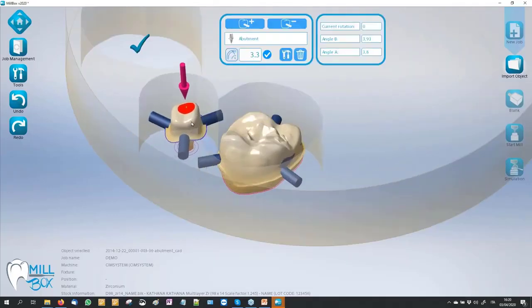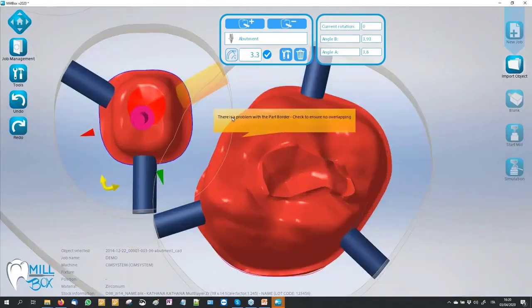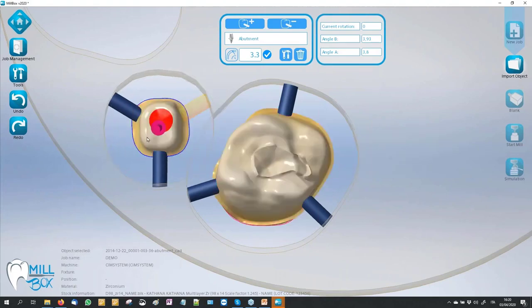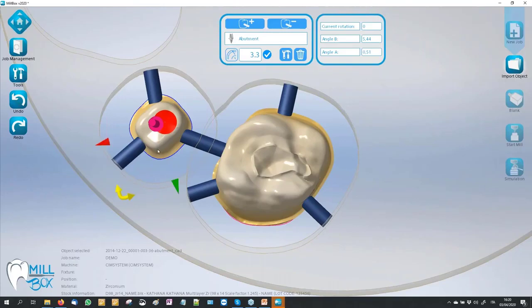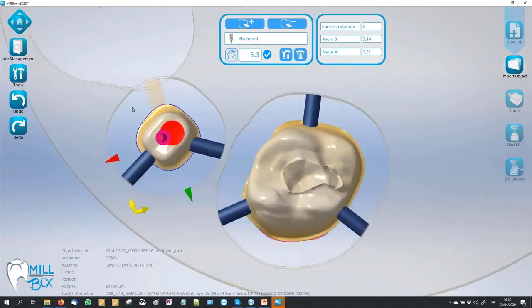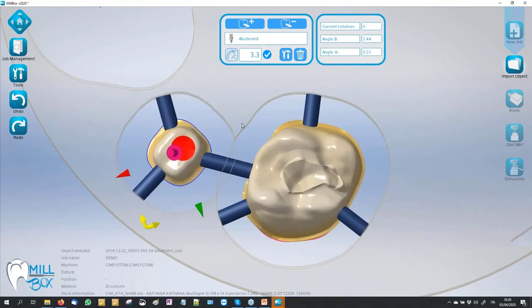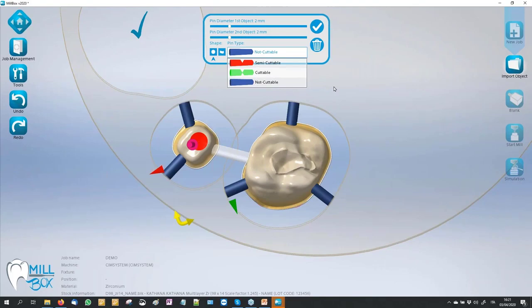If we move our object too near to another one, the software shows us a warning because the roughing area is over the crown. We can also rotate, and automatically you see the connectors stay attached to the crown. If a connector is in the air, it flashes to advise us. We have three kinds of connectors: semi-cutable, cutable, and not cutable. Semi-cutable means at the end of the milling process an operation cuts 50% of its diameter. Cutable (green color) means at the end of the milling process these connectors will be removed completely.